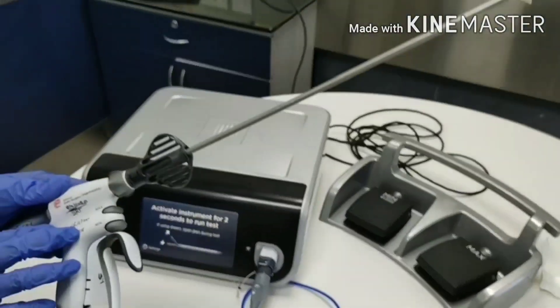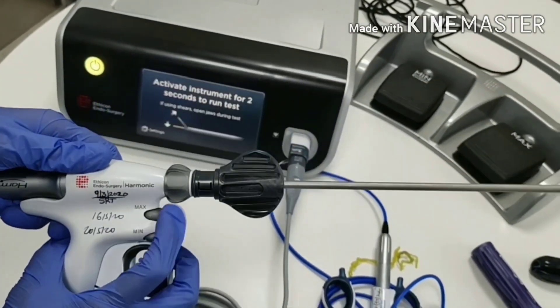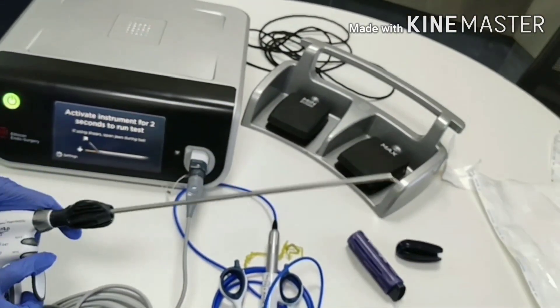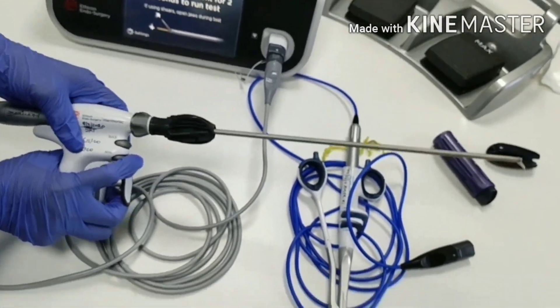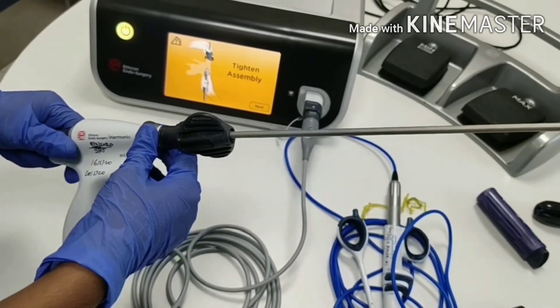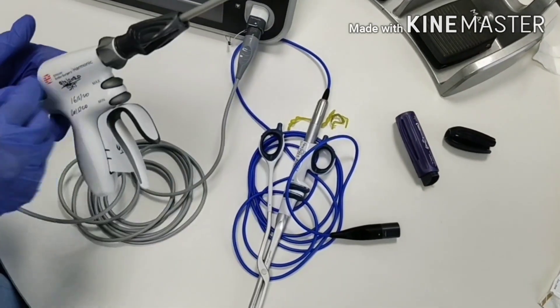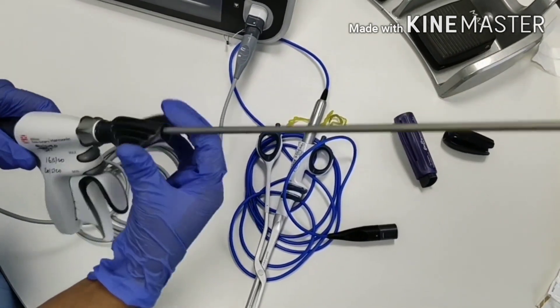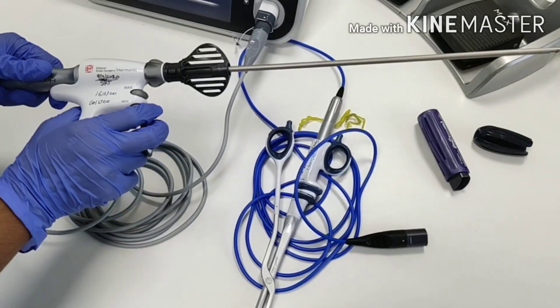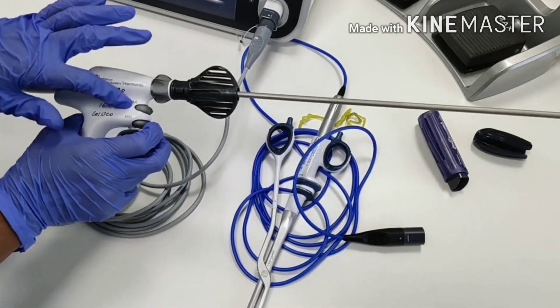Same message is showing: activate instrument for 2 seconds. This instrument also has maximum and minimum keys. This is minimum, this is maximum. Keep jaw open and press one key for 2 seconds to run the test. Redo the same test — press either the maximum or minimum key. Now the system is ready to use.